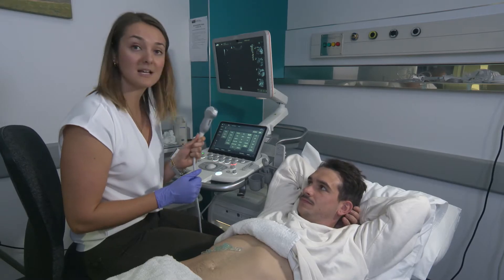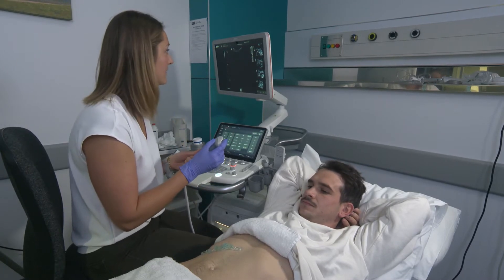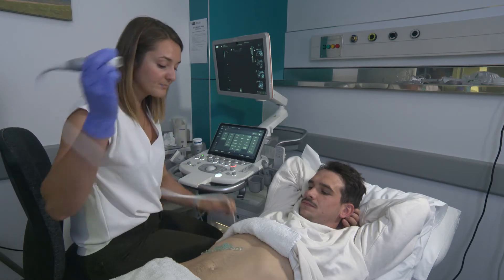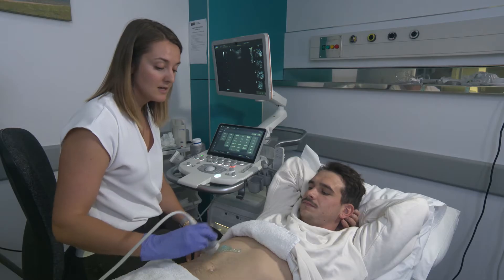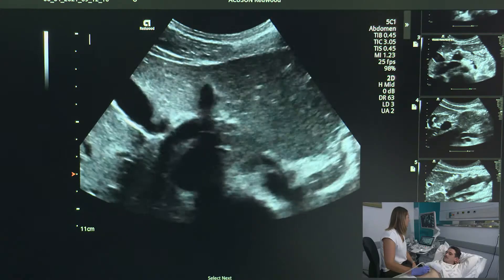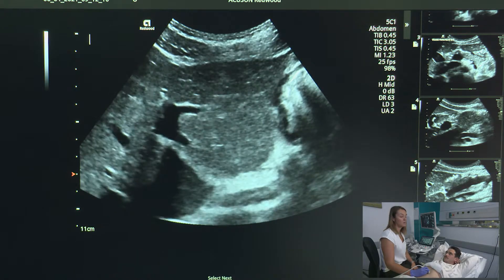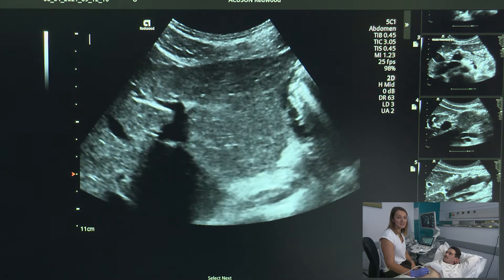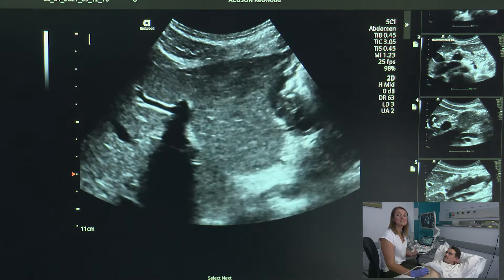The next thing I'm going to do is select my probe and I'm going to be using a 5C1 — a 5 curve linear — so I can get adequate depth and penetration. Before we actually start scanning, we want to make sure that we can identify the liver. It's always important that when we start scanning an organ, we start superior to that organ, so that if there are any exophytic lesions, we see them.